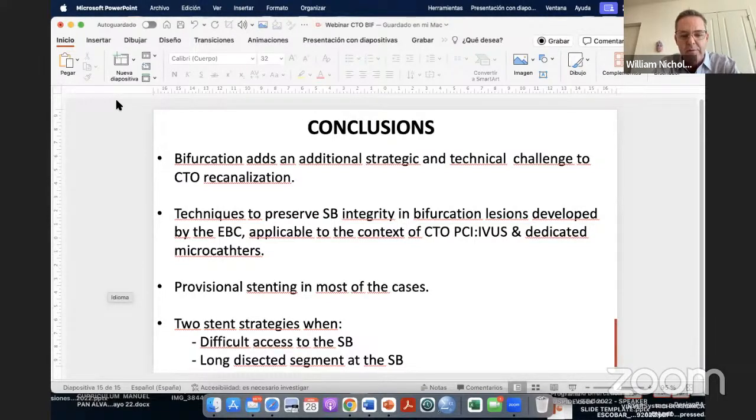It's just downstream. And so if you position the tip of the wire against the inner curvature of the bifurcation segment, you can sometimes sneak that wire into the side branch, and basically when the wire unfolds, it pushes that carina, pushes that flap out of the way, giving you access, which is really elegant, because it does keep it so that you have a confluence of your 2 wires in the same lumen, which allows you then to progress with bifurcation stenting or treatment in the usual fashion, almost always stenting in that scenario.